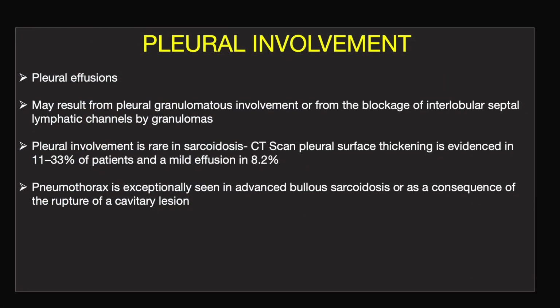Is pleural involvement common? It's not very common. It is rare. There are definitely, however, case reports which have been published about pleural effusion in sarcoidosis. And when it does occur, it occurs because of the pleural granulomatous involvement or because of lymphatic blockage because of the granulomas. So it's not very common, but it can be seen. It is reported. And pneumothorax can also be seen when there are huge bullae where there's a lot of destruction, especially in stage 4 sarcoid or because of a rupture of a cavitary lesion.